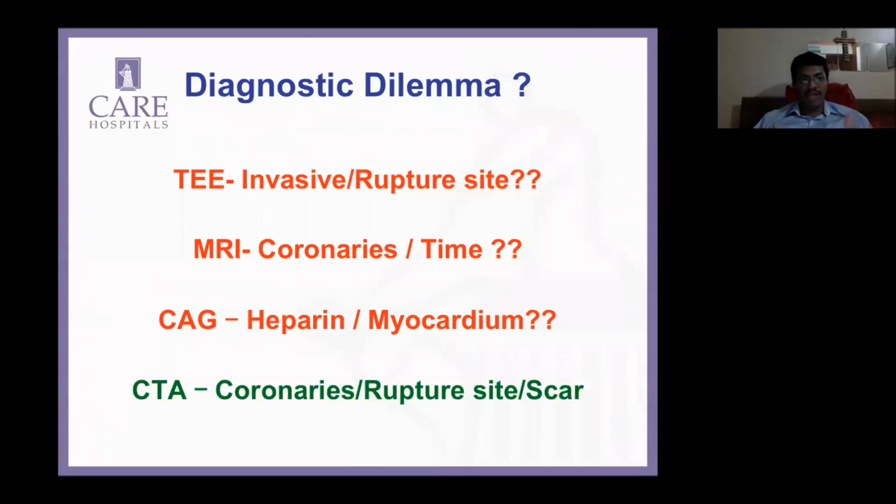So we have been looking at this group with CT. I have 12 of these patients. 3 have died. 1 just waited for finances, despite me saying that's a rupture, and died overnight. The other patient left the hospital, went to another hospital because they were unhappy with the plan for surgery, and died there. The third patient was actually my first patient, where nobody believed I could look at a rupture with CT. Nobody believed me, and the patient died.